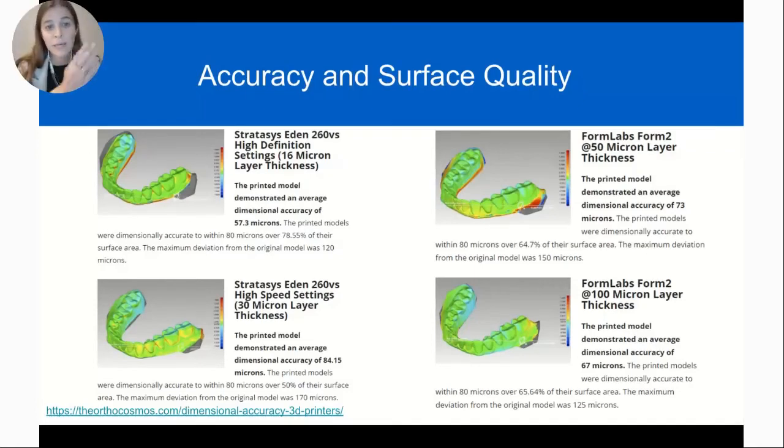Excellent. Yeah. So this is a very important point overall regarding the importance of accuracy. I mean, we are a very specialized and meticulous profession in dentistry overall. So accuracy is always a core part of our profession. We are almost like perfectionists in what we do. And although, of course, for the fitment of a crown, the adaptation to the tooth preparation and the margins is critical, also, as you were mentioning, this cross-arch accuracy and not having deformation within the molars that can alter the bite, it's super critical.